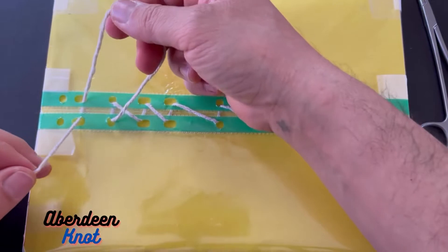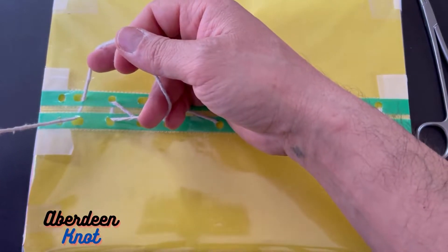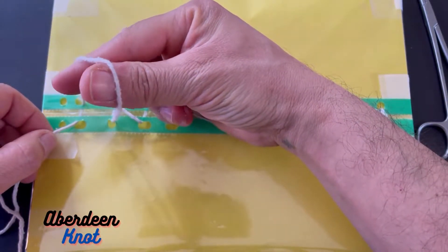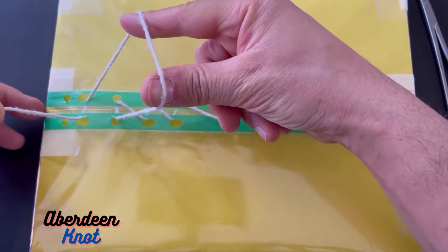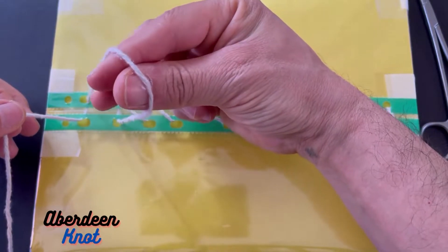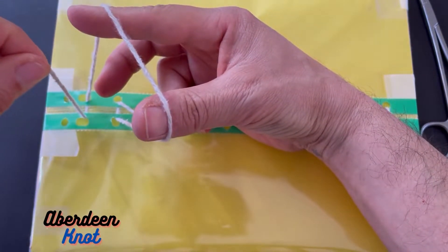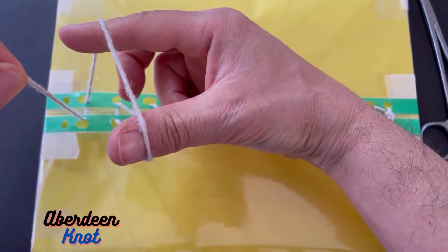Now if you look here, there is a loop between these two ends, and this is a free end — this is where the needle is attached. In the loop we'll put three fingers: thumb, index, and middle finger. We open thumb and index so it's almost like a triangle, and then we maintain pressure on this — we're holding it, not pulling too hard, just stopping it from pulling this way or that way.